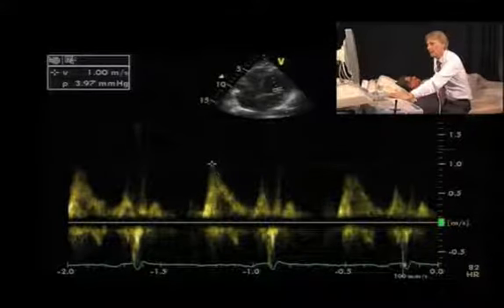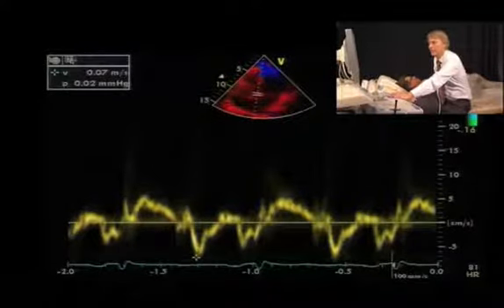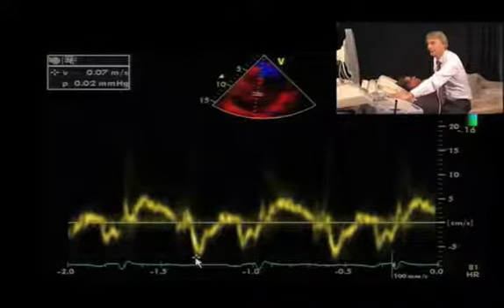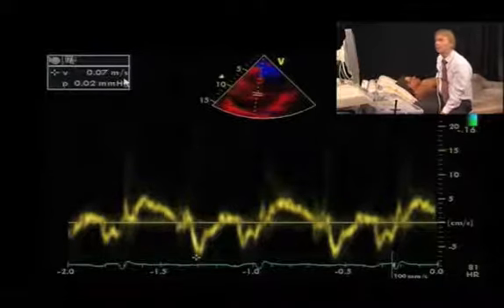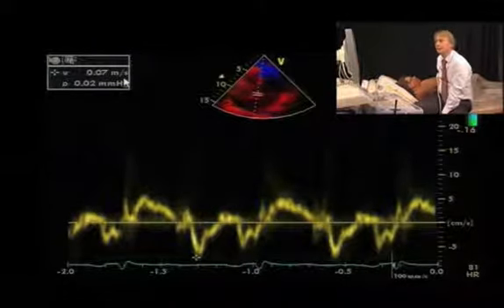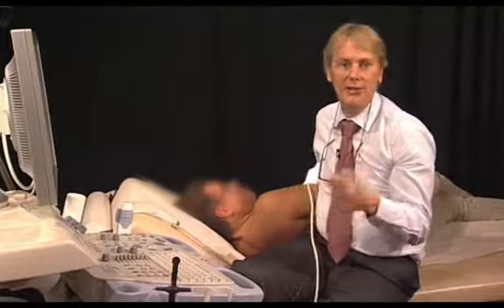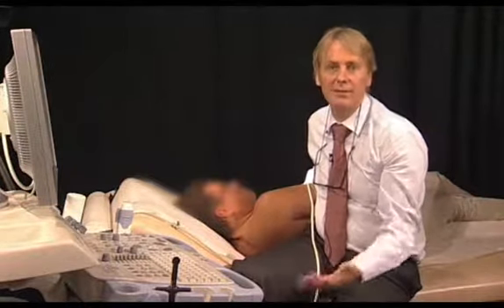To further elucidate that, we will then perform a tissue Doppler spectrum across the mitral annulus and measure the maximal E prime velocity, which is 0.07. And if we look at the ratio, we get a value of 13, which would mean that the patient has elevated left atrial filling pressure. So, in summary, this cannot be normal diastolic function, but it has to be pseudonormal diastolic function with mildly or moderately elevated left atrial filling pressure.